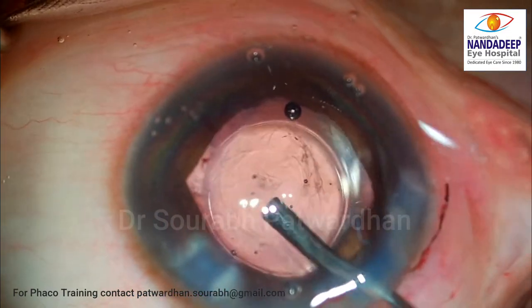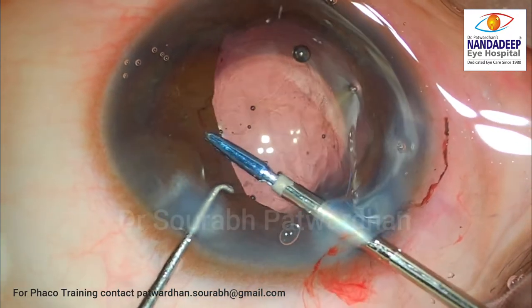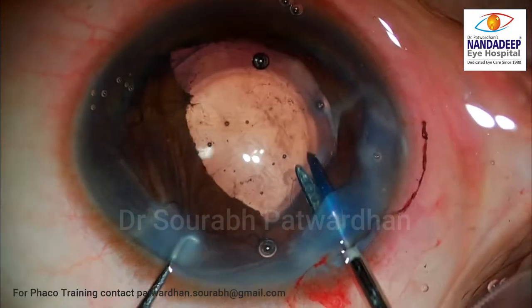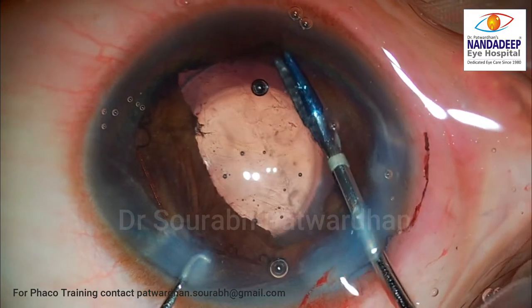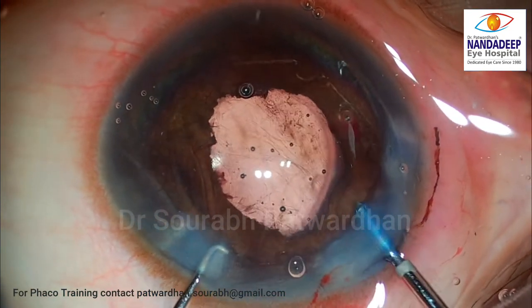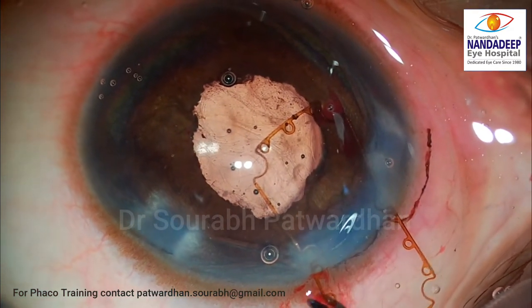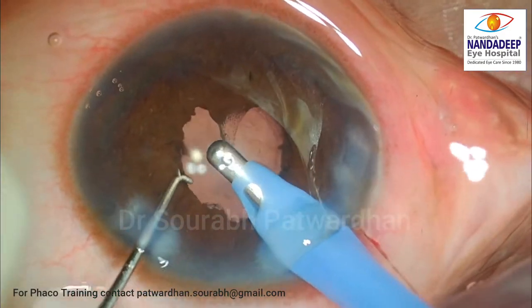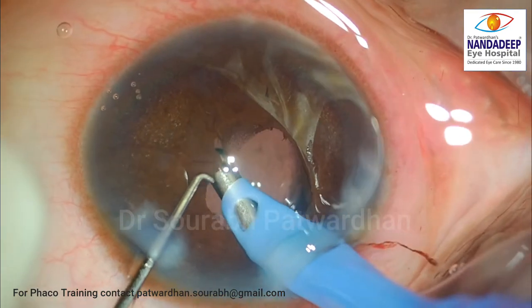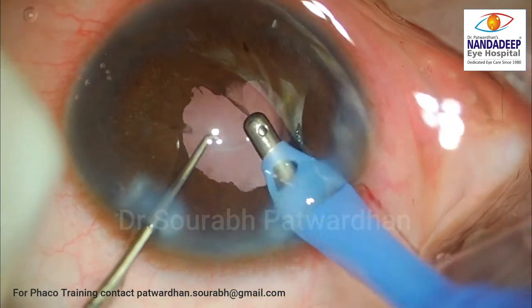Now it's time to remove the B-hex ring, done using the same 23-gauge forceps. We just have to dislodge the B-hex ring and bring it up over the iris — hold the flanges which are above the iris and pull them to the center very carefully. It's a very thin, flexible device and can be removed from a very small incision; even a sideport incision can be used. After removal of B-hex, I am going to remove all the viscoelastic from the anterior chamber as well as from the bag — it's very important to reduce post-operative inflammation.